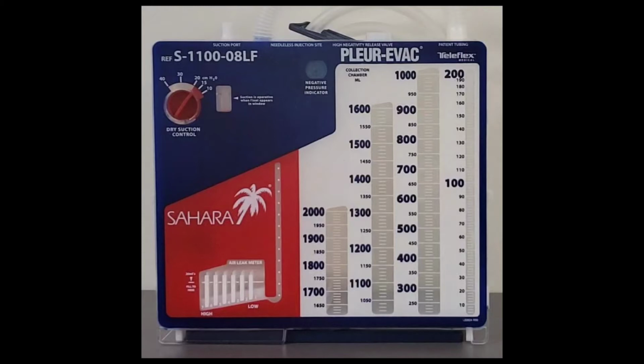Now let's say your patient has been set at 20, but now the provider wants you to decrease the negative pressure to 10. You can adjust the pressure by turning the dial, but this is not all. The system still has a negative pressure of 20 in it. You must release that extra pressure by pressing down on the negative pressure release valve here. You might even hear the air escape with a quiet hissing sound.